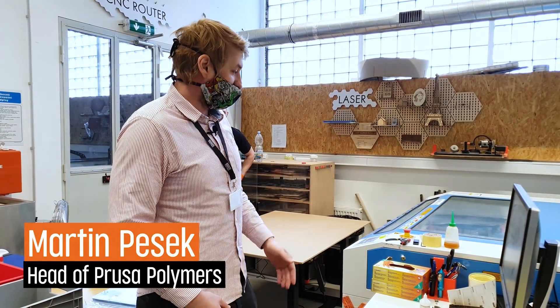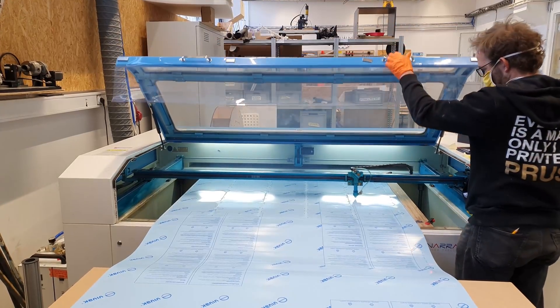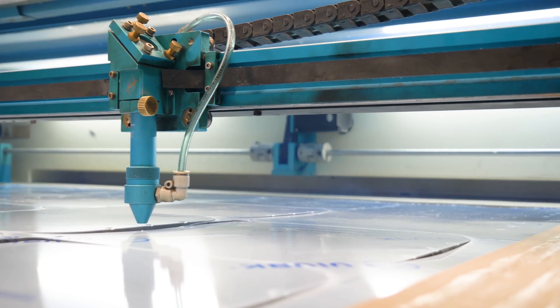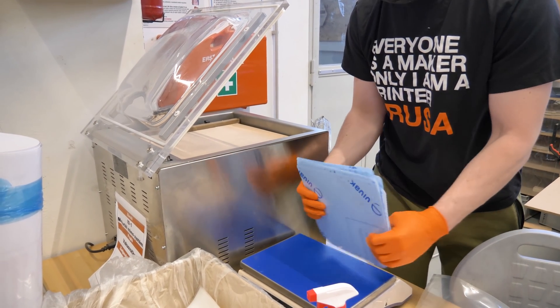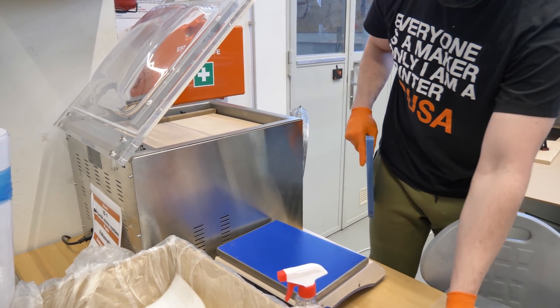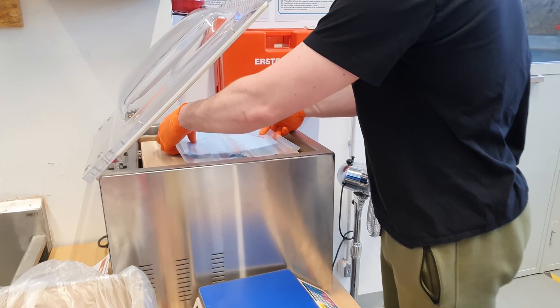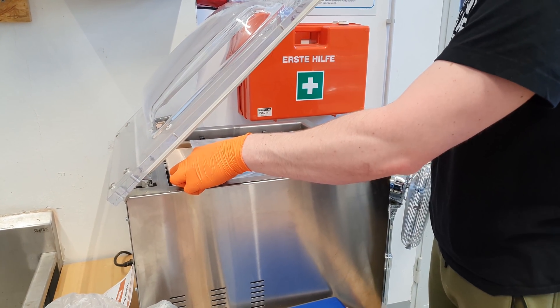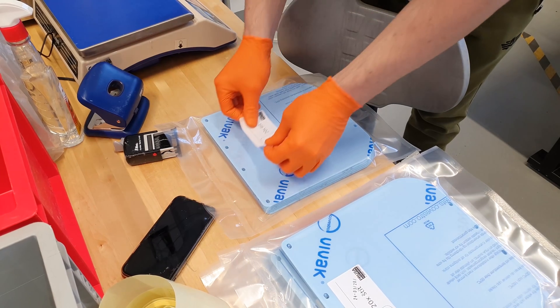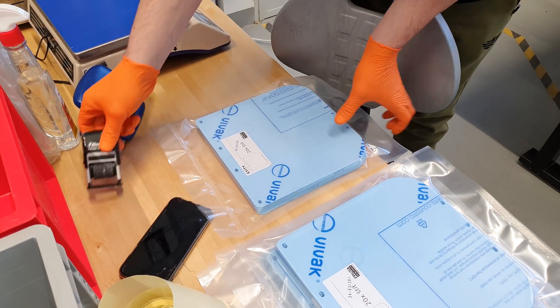At this workplace, the laser plotter cuts out visors. They're made from PETG foil, 0.5 mm thick, and we can make 40 visors from one sheet. Once the lasering is finished, the operator takes the parts and checks that they're not scratched. Then they're packed 20 pieces at a time and vacuumed in protective packaging. Those packages will be taken upstairs where they'll be added to other parts in the complete package for shipping.